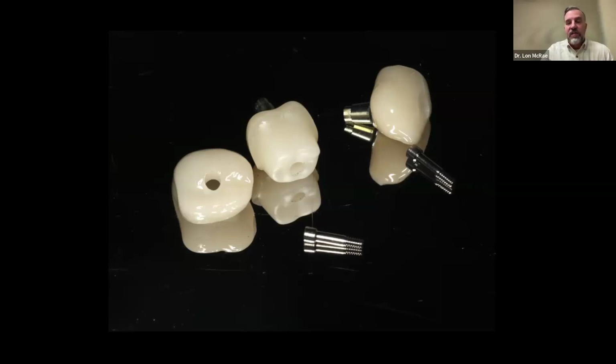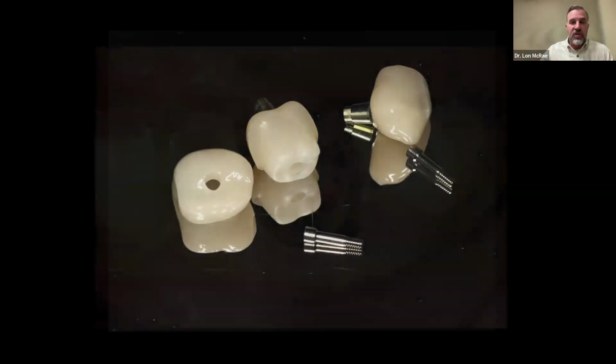The very last one is a temporary abutment. That is, if I don't have enough stability, then that's my backup. My backup is to place that temporary abutment on day 1 of surgery to also seal that socket. After 4 to 6 months, I can place that final abutment and take a final impression just like a traditional crown. So I'm going to go through this and show you how this was done.